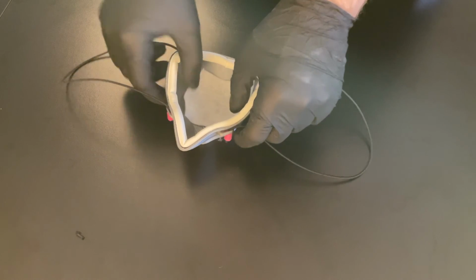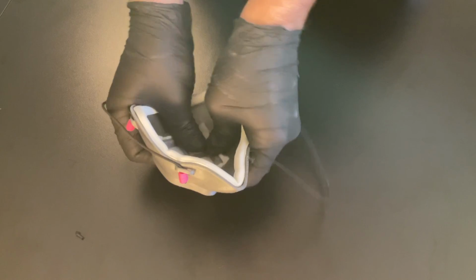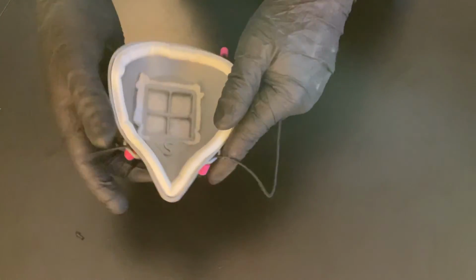Finally, filter installation. Place pre-cut MERV 8 or MERV 13 filters into the empty square and use the nose gasket to snap the filter into place. The filter should sit snugly into place. And then your 3D mask is complete.